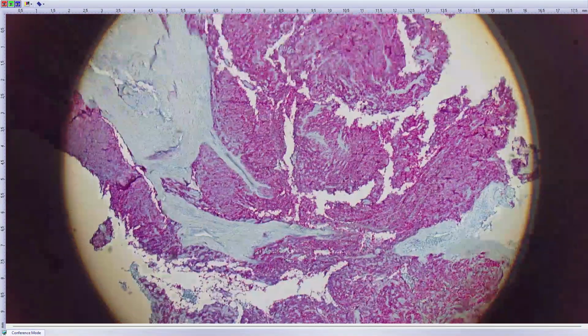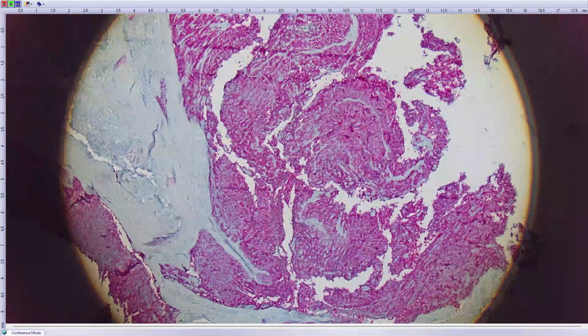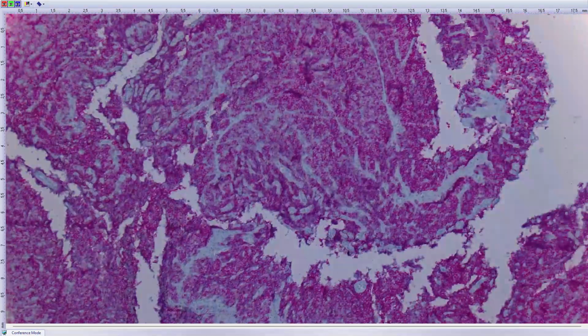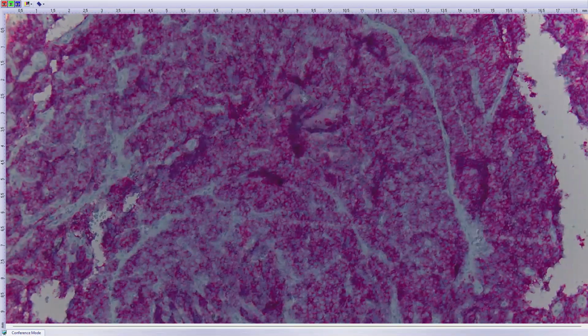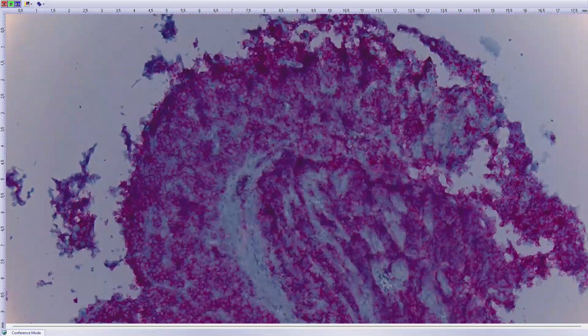So although most people want to have this diagnosis confirmed by genetics, there are pretty good immunohistochemical markers which can highly increase the pre-test likelihood before molecular testing, which will give you a higher chance of getting Ewing sarcoma right. This is CD99, old stain, but still works pretty well. It's very non-specific, but when you see this diffuse, strong membranous expression, the specificity highly increases. Still not perfectly specific, but it helps. It's very unlikely to see Ewing sarcoma without this diffuse membranous positivity. It exists, but it's very rare.